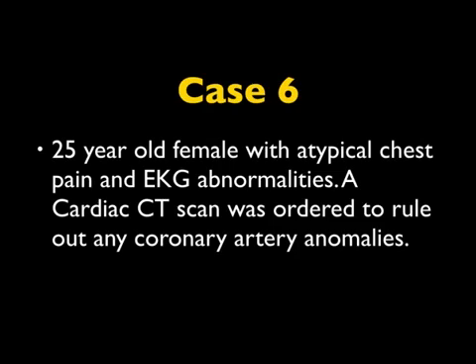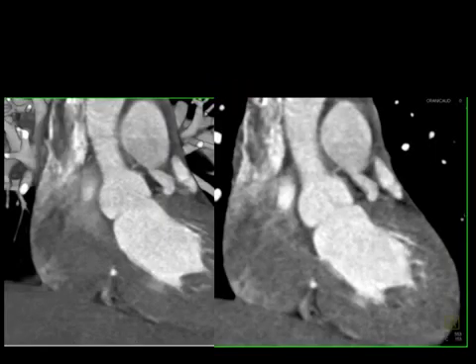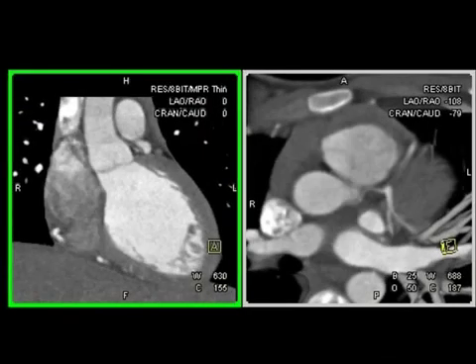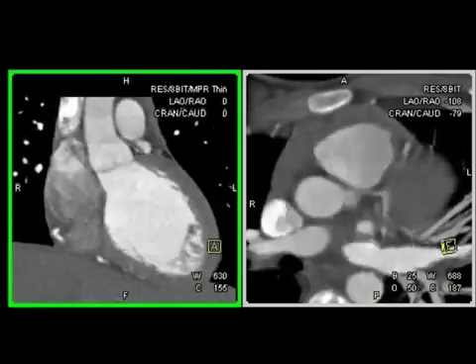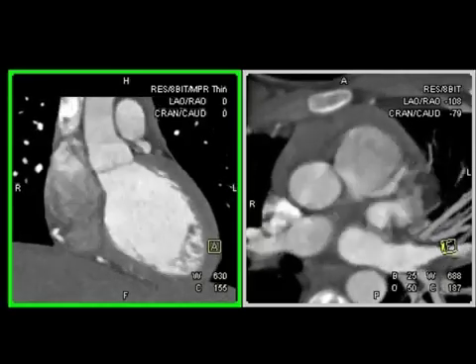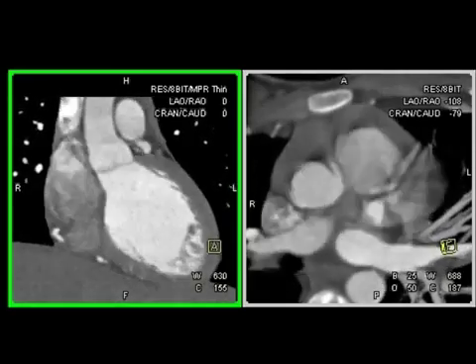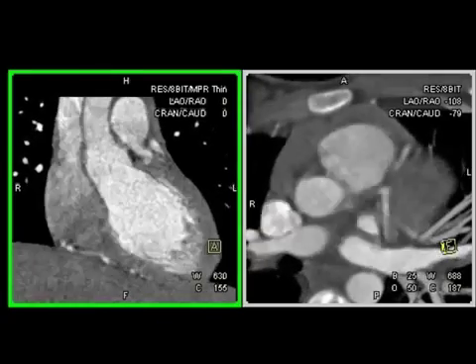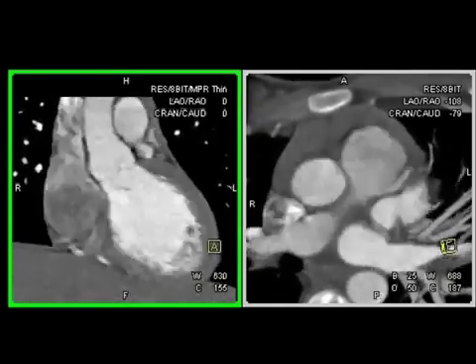The patient was 25 years old and they thought perhaps she had an anomalous coronary artery. Looking carefully at the images, what looks like the left coronary appears to be coming from the pulmonary artery. Looking at the image in motion, the coronary artery is actually coming off the pulmonary outflow tract.